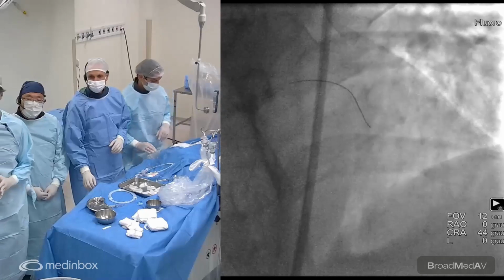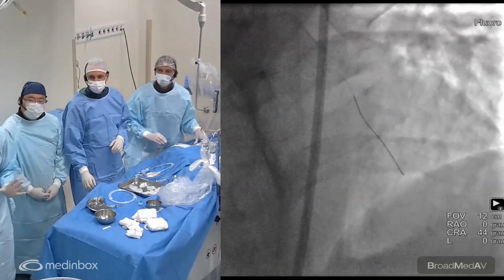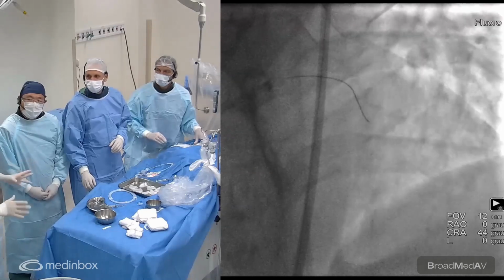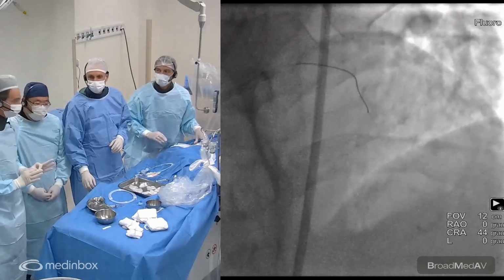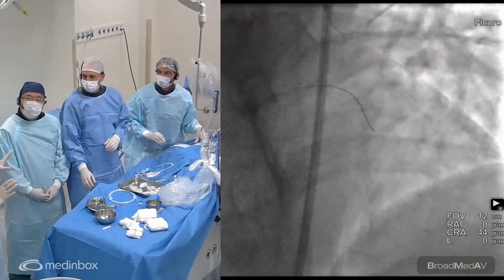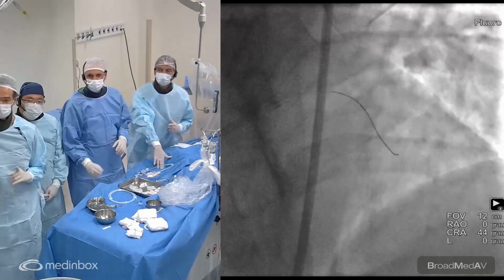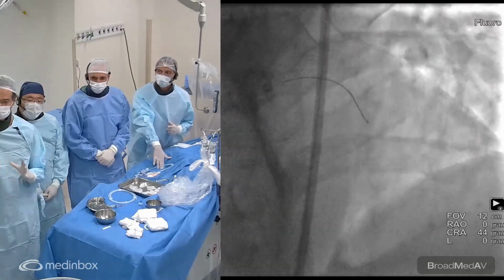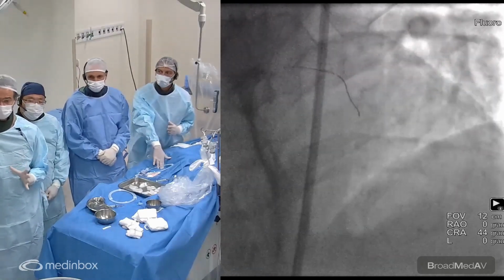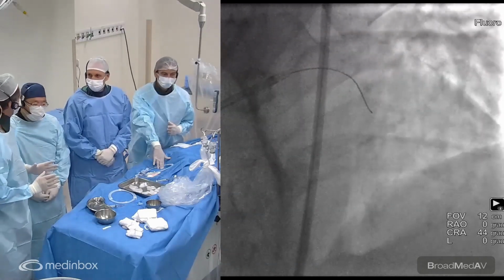Okay. Easily, and you can get through the total occlusion of 2 months' age. I mean, it's not hard to do this, but you need to be perfect, because sometimes if you go to the wall, the procedure gets so complicated. Yeah. So every simple procedure needs you to be very concentrated and to use all the rules you know to treat a CTO.